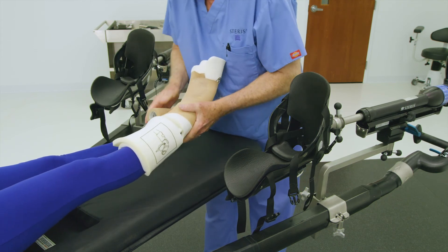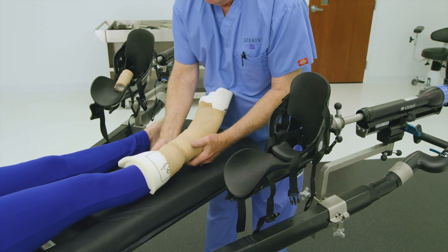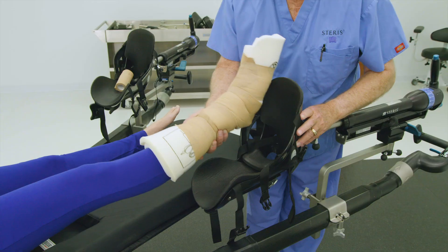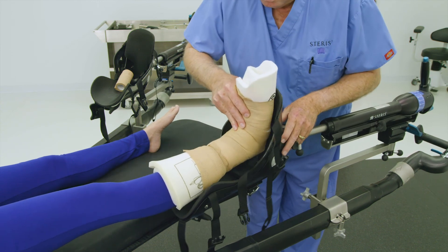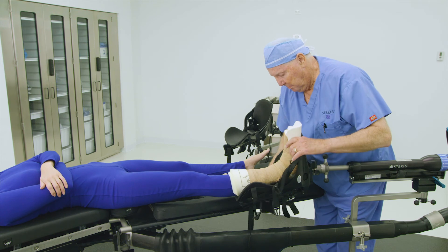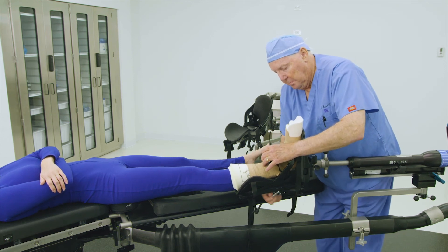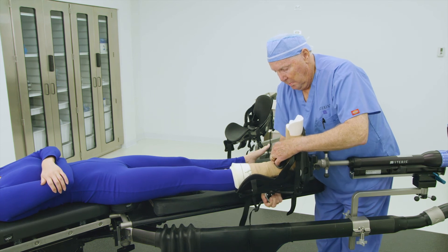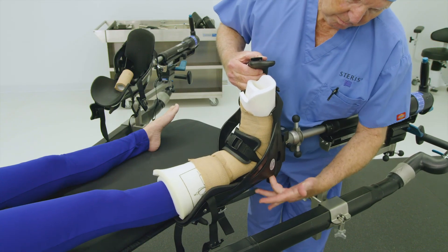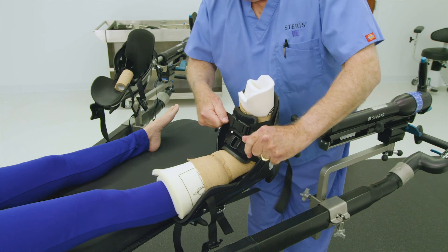If using the Steris disposable pad, instructions for placement are located on the disposable pad itself. Once the foot is prepped with padding, ensure that the floating Achilles tendon pad is positioned appropriately as shown here, and is not stuffed down into the heel area. Place the patient's foot into the boot so that the heel rests against the bottom footplate, and the foam padding is as close to the patient's calf as possible. Ensure the Achilles pad is positioned against the Achilles tendon. Next, buckle the middle strap and ensure the strap is directly over top of the ankle. On the underside of the boot, tighten the middle strap using the strap ratchet assembly until the ankle is secure. Finally, buckle the toe and calf straps and tighten straps securely, ensuring all buckles are centered. Failure to follow these steps could lead to the patient's foot slipping out of the traction boot.